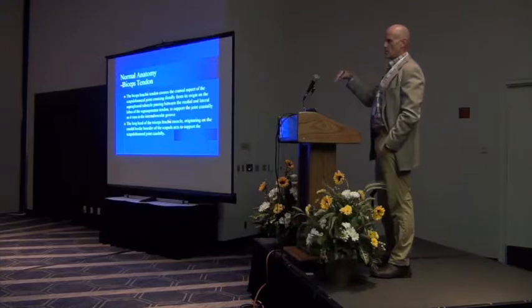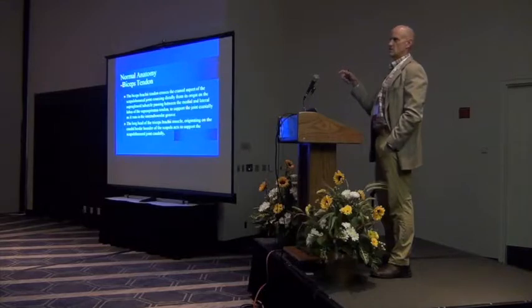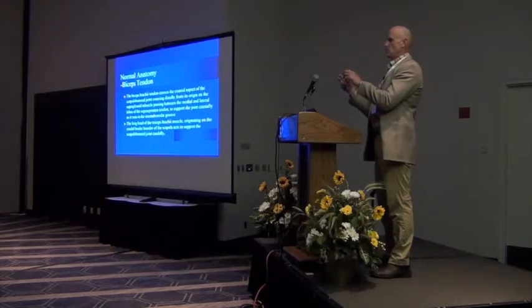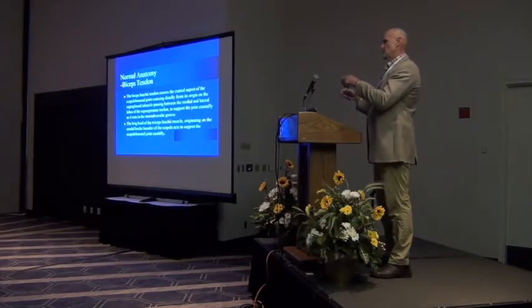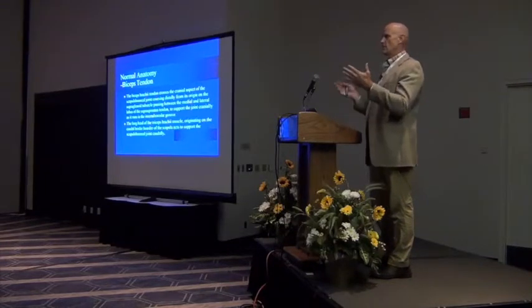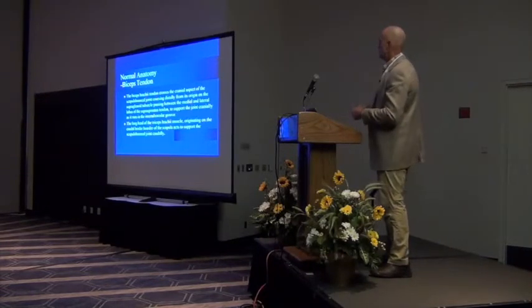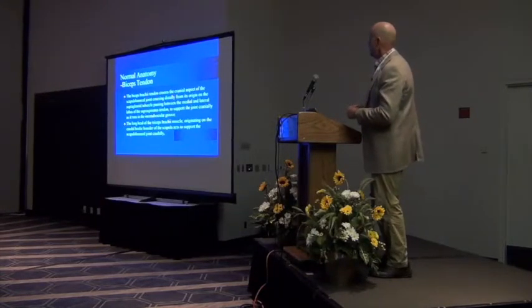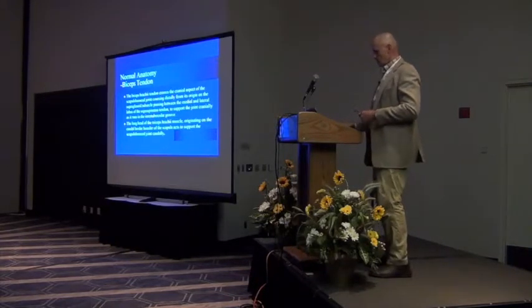Dives around, and I'll show you on ultrasound that there is a very heterogeneous echogenicity to that structure just after the supraglenoid tubercle. As it comes down a little bit closer to the intertubercular groove, it starts to form two bundles with an isthmus between them, the lateral being bigger than the medial, the lateral being more superficial than the medial. Unfortunately, it's very difficult to get both of those in the same scan head, so sometimes we put them with a split screen and put them side by side. And then on the back side, we've got the long head of the triceps apparatus.